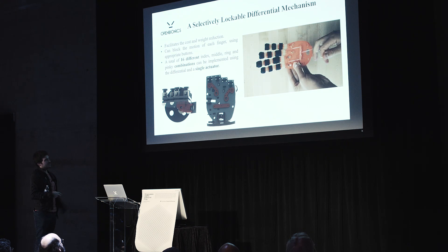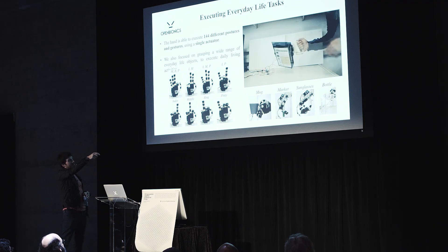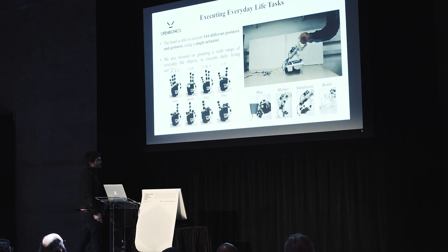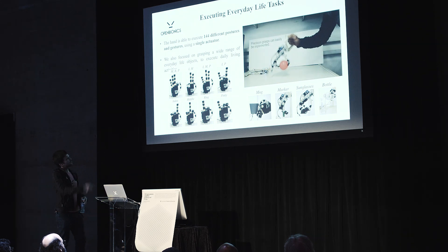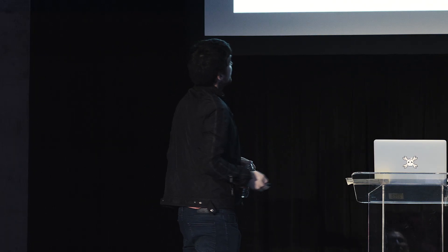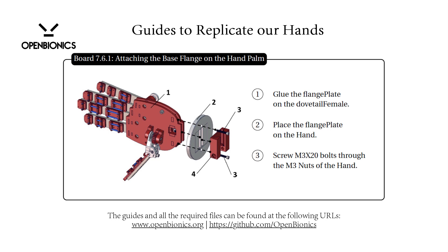You can see here the differential mechanism with the palm open, the different grasping postures and gestures that can be replicated, and some examples of the robot hand grasping and interacting with the environment. This new hand can grasp a big bottle of water that weighs 1.5 kilos. On our website, you can find guides to replicate not only the robot hands but also the prosthetic hands.